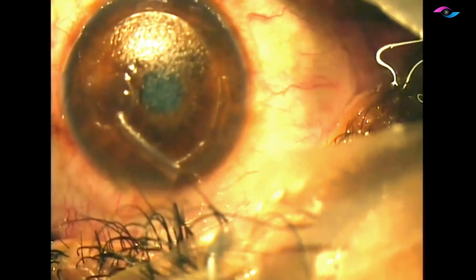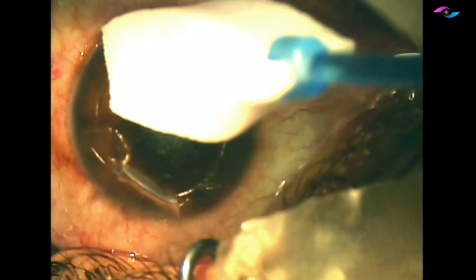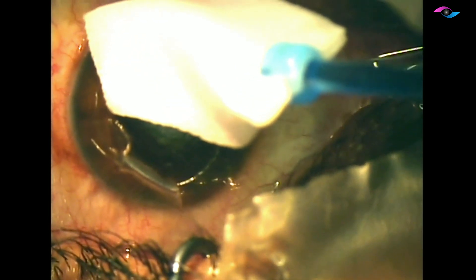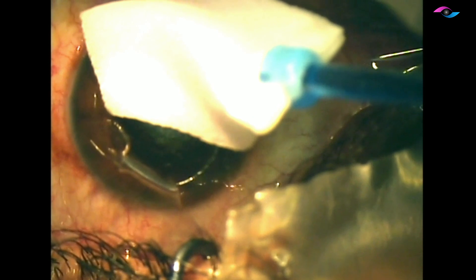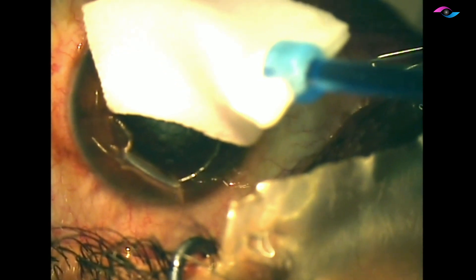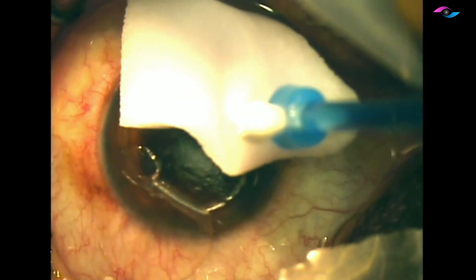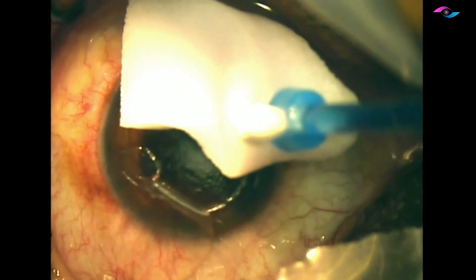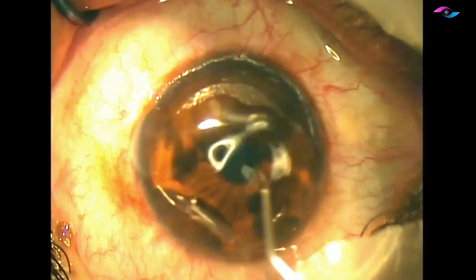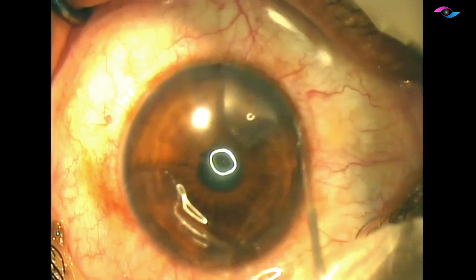I'm using a Merocel sponge soaked with mitomycin C 0.02% and keeping it on the stromal surface for a period of one minute. This also helps in preventing recurrences of epithelial ingrowth. It is very important that we wash off this mitomycin C thoroughly with 40 cc of water.